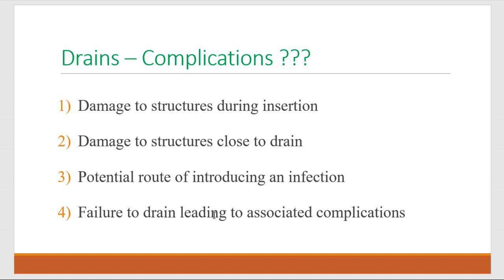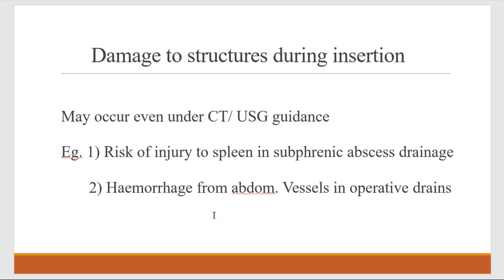So there are four major groups of complications associated with drain placement. Damage to structures during insertion. After the insertion, the surrounding structures may get damaged. Introducing an infection, and failure to drain with associated complications. One by one, we are taking the examples.